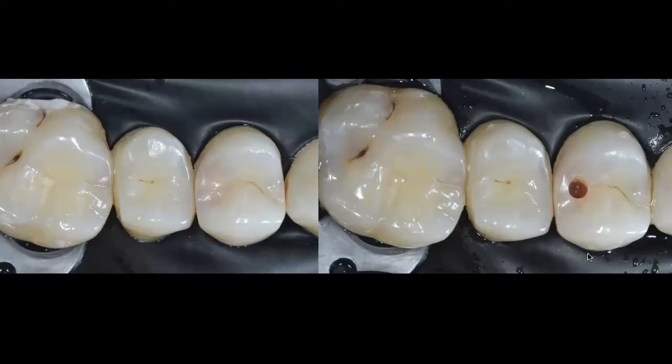Again, you see me going maybe half of a millimeter to a millimeter away from the proximal surface of the neighboring tooth, literally staying away from that marginal ridge and just pushing and dropping that burr into that infected dentin. And if you look at the left hand side, you can see that pinkish brownish shadow underneath the enamel that we normally see in these lesions that actually started from the proximal area, normally from lack of flossing in our patients.